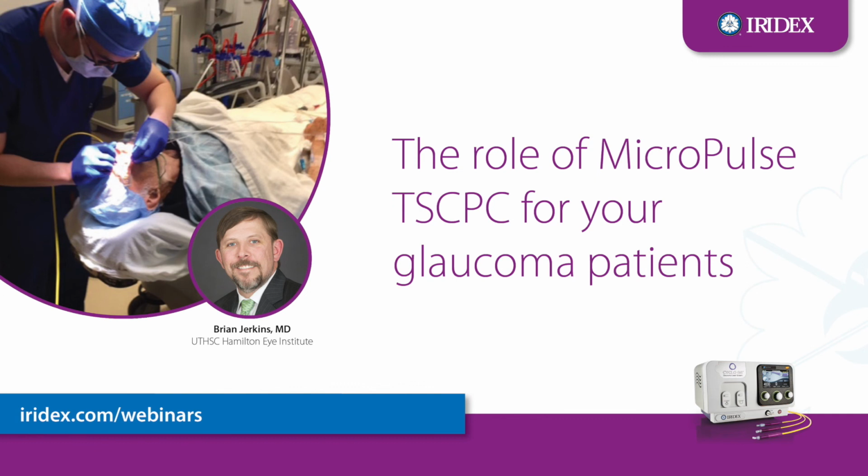Have you experienced any hypotony at all with the procedure? I have had 1 or 2. There's one lady that I know was hypotonous for a good 4 to 6 weeks afterwards. That's since resolved, and I might put an asterisk with that. This was a patient who had already had a previous tube, just did not tolerate any medication. And they were a little elderly, so I may have overtreated them a little bit, but it's since resolved after about 5 to 6 weeks. I've not had a patient with persistent hypotony with this, and that's not something I could say in the past with G probes.